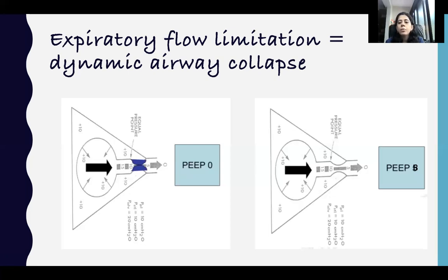So when we intubate a patient, for example, I find that the auto PEEP is 8, and after giving medications, my bronchospasm starts decreasing, and more alveoli are now communicating with the central airway, because these airways have started opening up. So we may actually find the auto PEEP increasing for a certain amount of time.